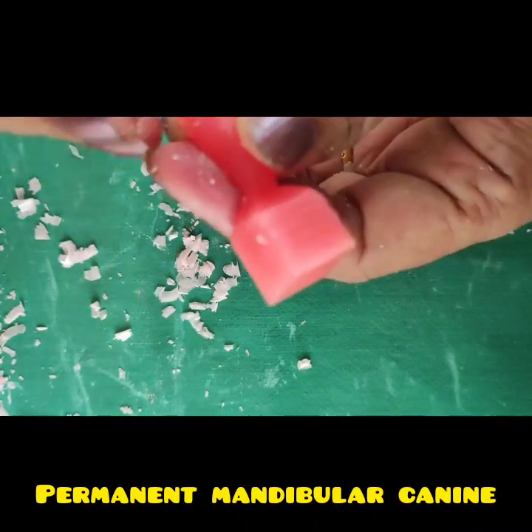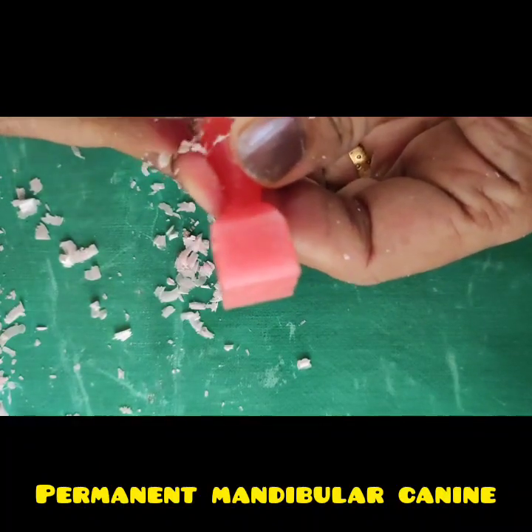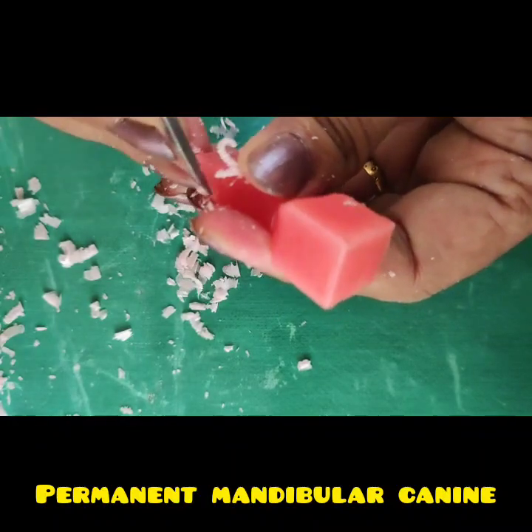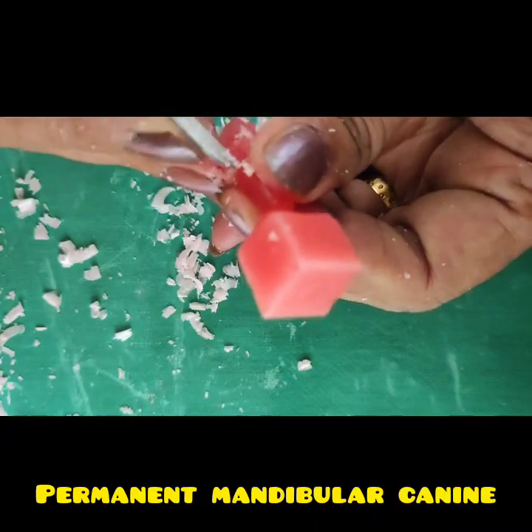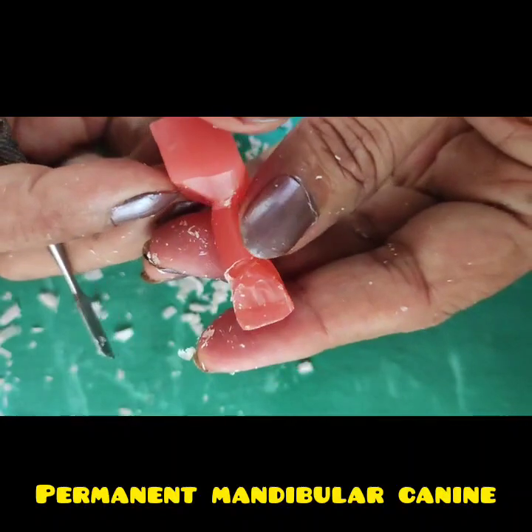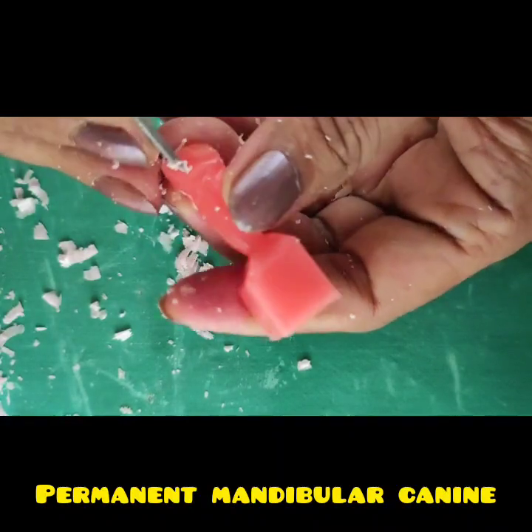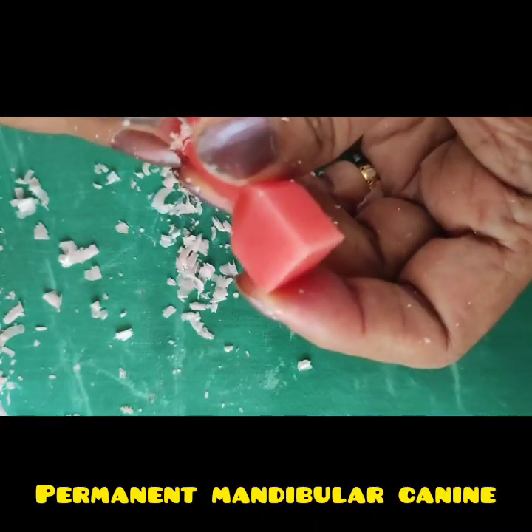And then the cingulum, reduce the proximal surface, move towards the cingulum from both the sides, mesial and distal, and then after you get it, join both below the cingulum, and this is how you will get a prominent cingulum and convert the squarish labial surface into a nice U shape.